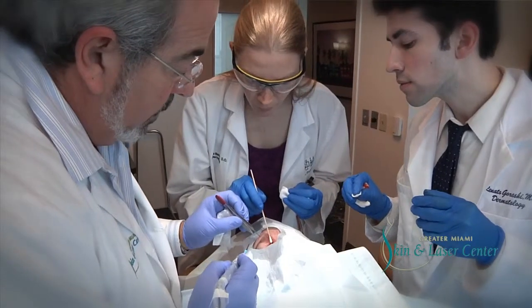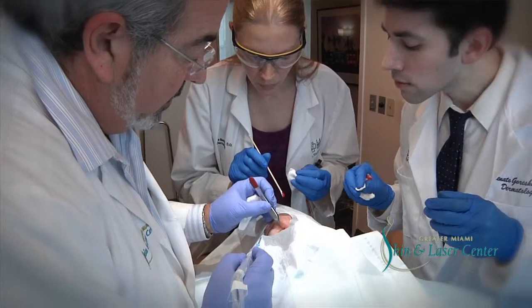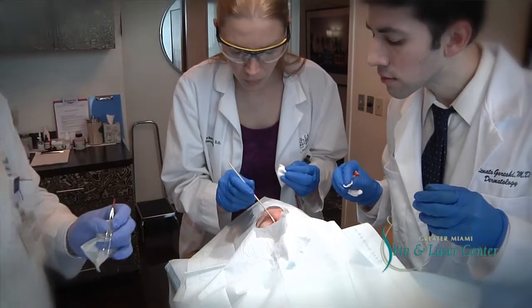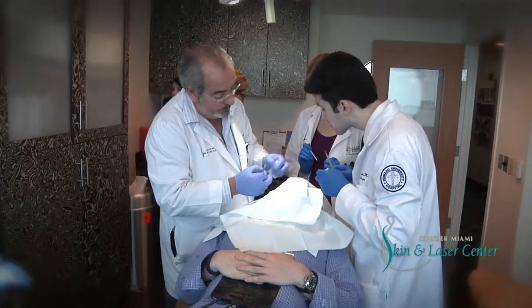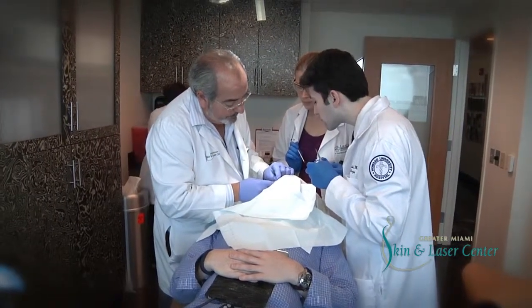Most cases are pretty much negative or clear of tumor within one to two layers. Occasionally, however, in a complicated case, they can go up to as many as seven or eight layers. But the goal here is to remove the entire tumor, preserving as much normal tissue as possible.